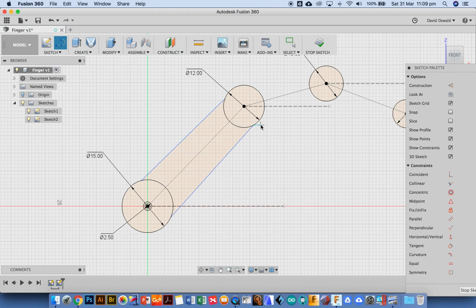Now these have to be tangent to these circles. At the moment they're not. There's an angle there. So I'll go across to this tool, the tangency tool. I click on it and I say I want that line and that circle to be tangent. This little symbol will appear. I want that line and this circle. Line and circle. Line and circle. So what you have is a perfectly smooth transition of those lines around those circles.